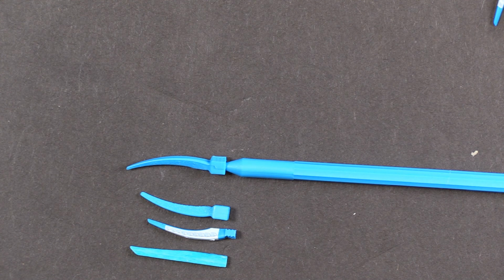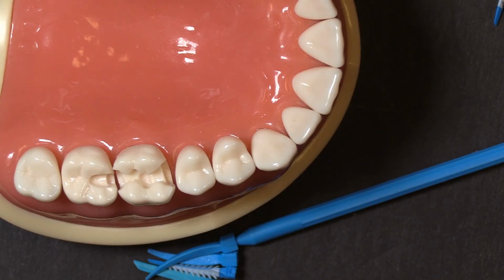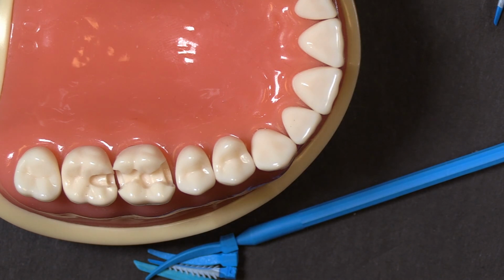Tips for rounding the marginal ridges. You pop a band in and take a look at, oh, there's one right here.